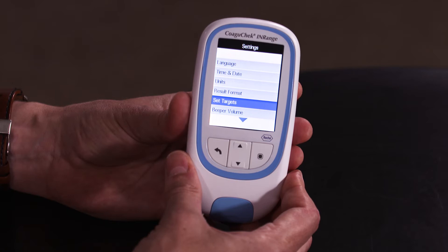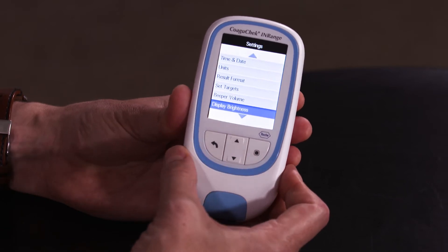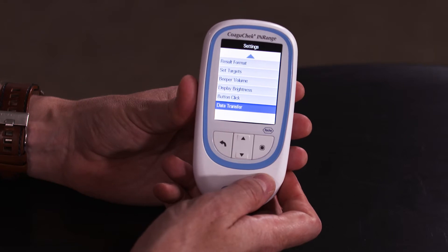You can set your target range and you can adjust the volume of the beeper, the brightness of the screen, and you can choose to switch the button click on or off. Data transfer gives you the option to transfer data from the device to your PC.